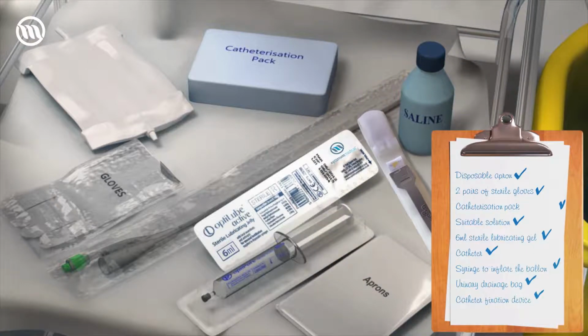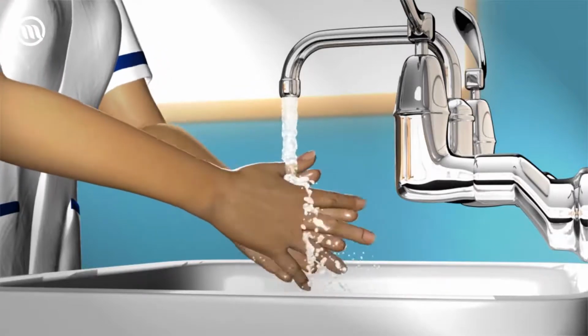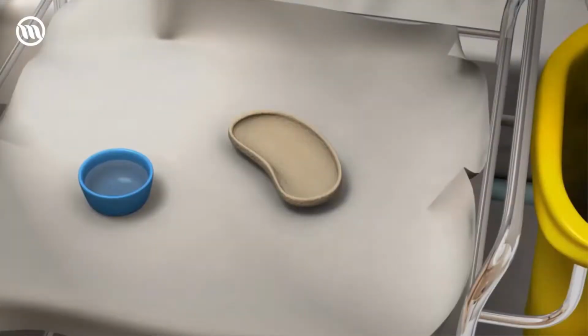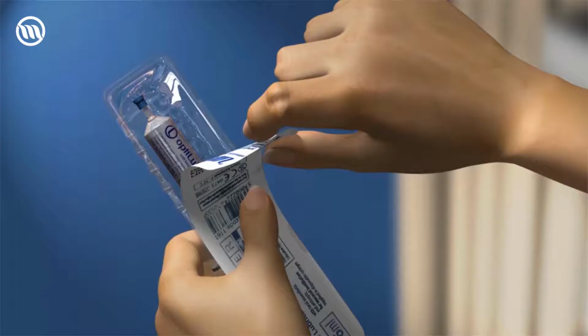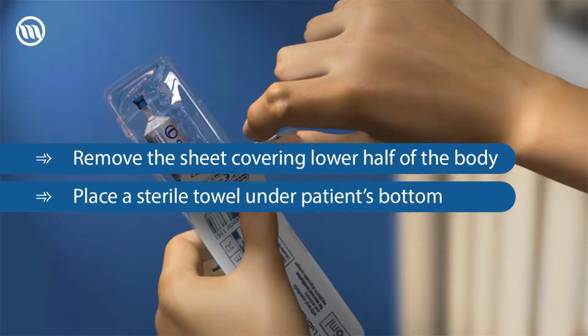Take the trolley and equipment to the patient and wash your hands. Put on the apron, open your catheter and position a waste bag. Using a non-touch technique, open your equipment onto the sterile field. Remove the sheet covering the lower half of the body and position a towel or disposable pad under the patient's bottom to protect the bed.